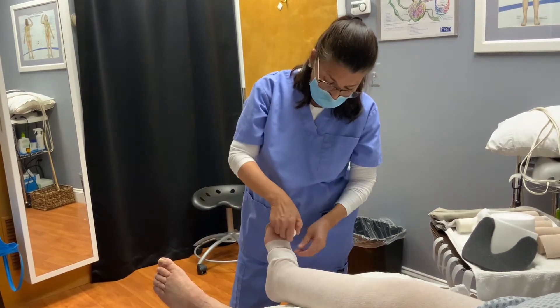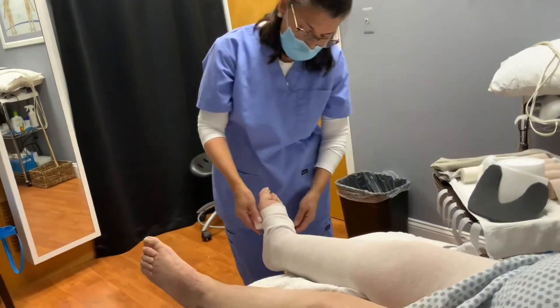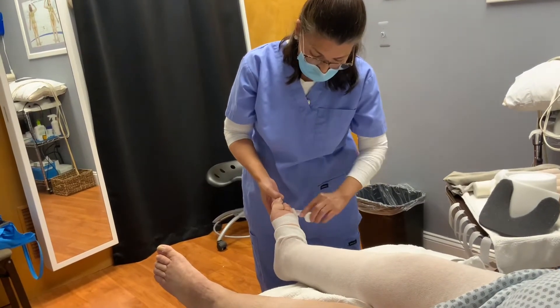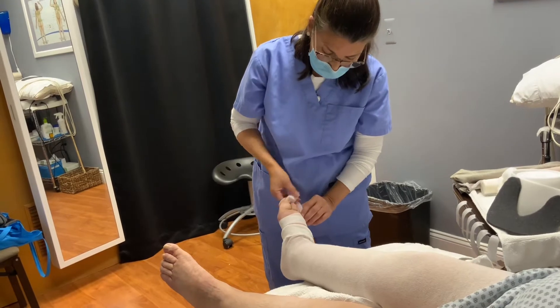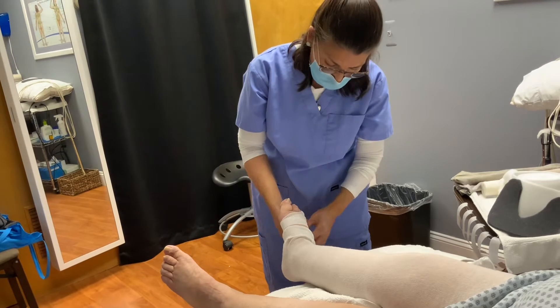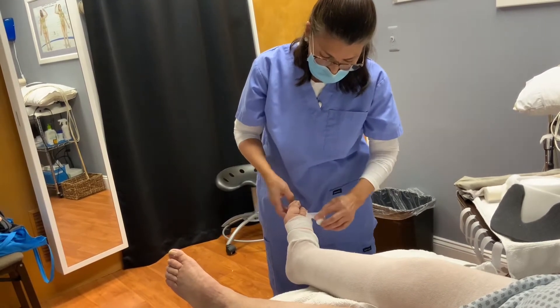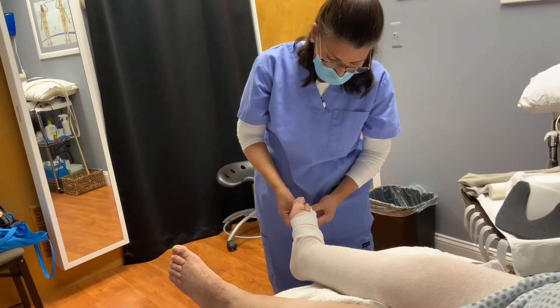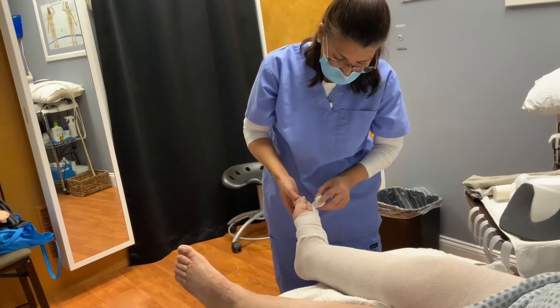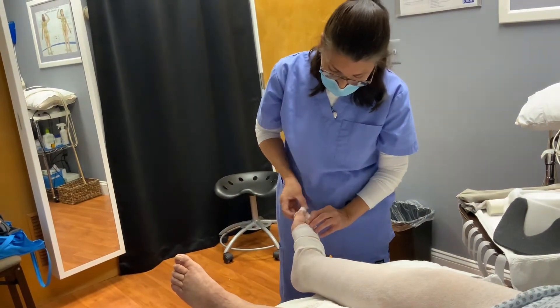I start with the little toe, go around it twice, come back around, and we keep going until we get to the big toe. This should not dig into the skin of the patient. It should lay on nice and flat, and we go around each toe twice. You want to make sure there is enough coverage on each toe to prevent any fluid from accumulating in the open spots.